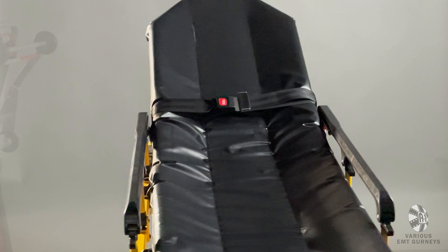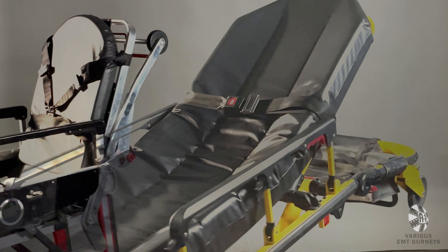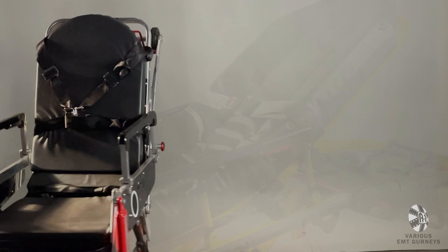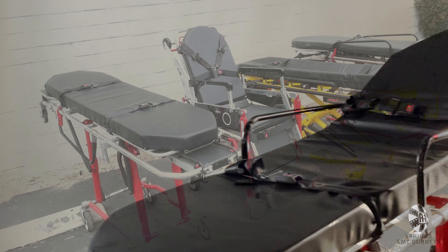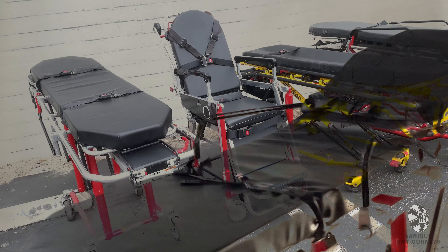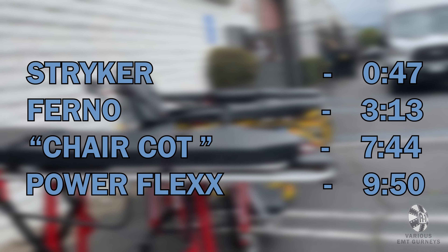In this video, we will be discussing how to use our various EMT gurneys. Each style has slightly different mechanisms for operation. So instead of showing one instructional for each gurney, we have split this video into four different chapters. Each gurney is designed to be used by two paramedics, so some of these moves will require two people. Feel free to move to the chapter that corresponds to the gurney you have rented.